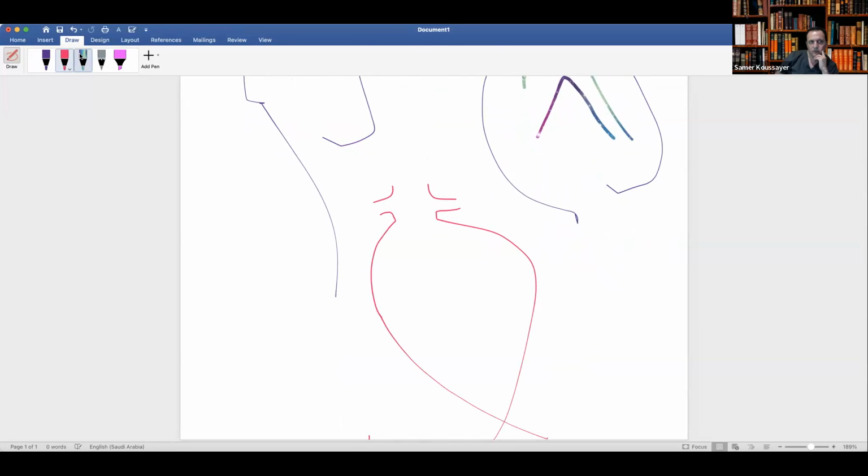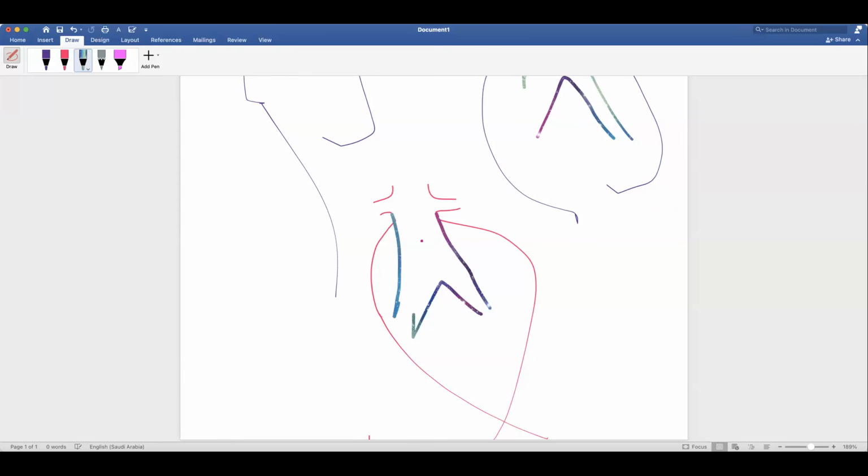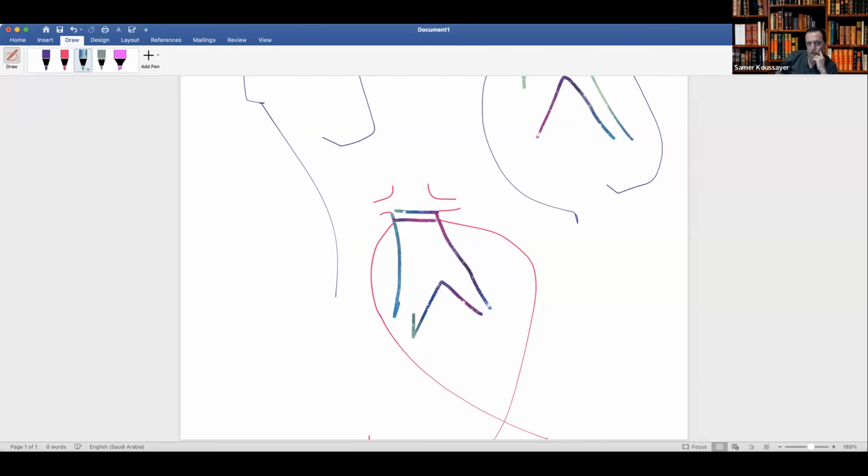Okay, so here when you put the graft like that, you still have a neck here, 22 and 22. So here it's 26. You still have 4 millimeters here, right? But when you want to go 10, you go up to here, 10. Here it is like 32. Correct? So it is not touching the aorta. So you cannot say I have 4 millimeters, I can use Endo Anchor. It will not work here.